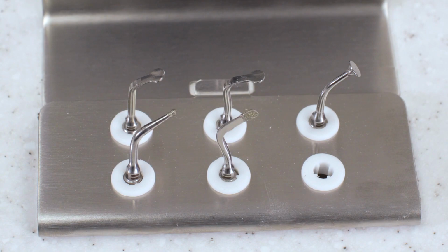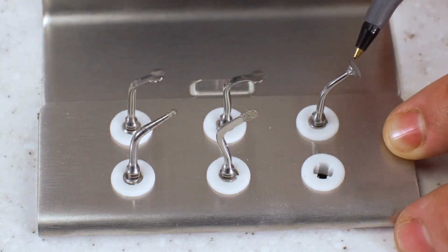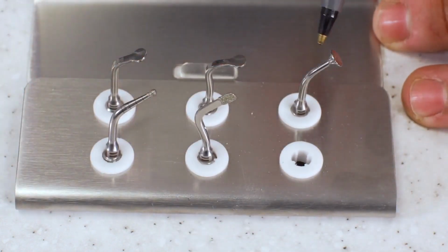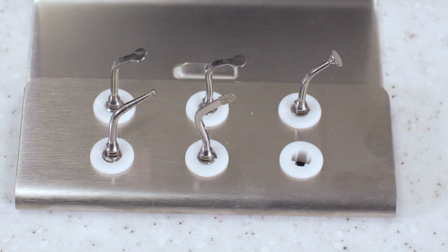And then you have this mushroom head here for retracting the Schneiderian membrane. And then you have these tips in here for separating the membrane even further once you're inside. So you have 2 of the diamond coated for creating the window, this mushroom tip for separating the membrane, and then these 2 spreaders here for separating the membrane completely away from the bone. So this is a nice way to open into the sinus while removing bone and not perforating the membrane, which is obviously the main goal for a lateral sinus approach.